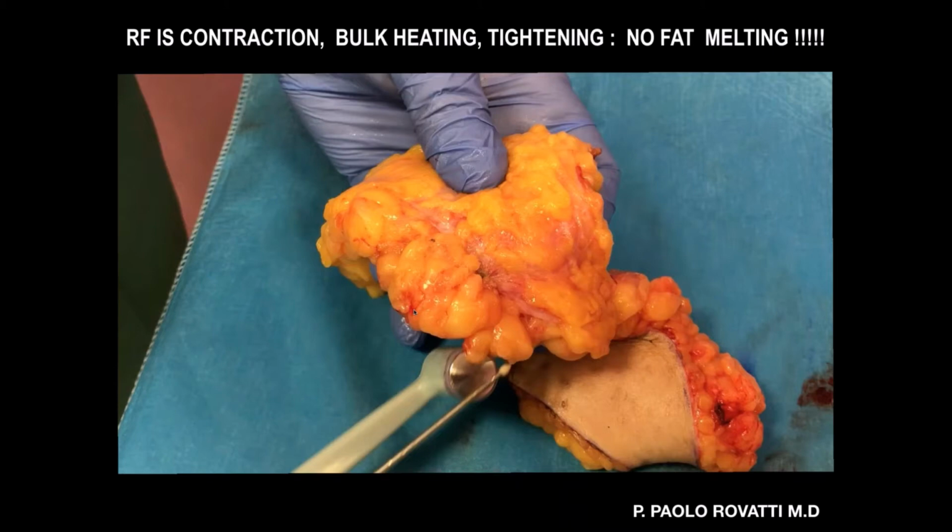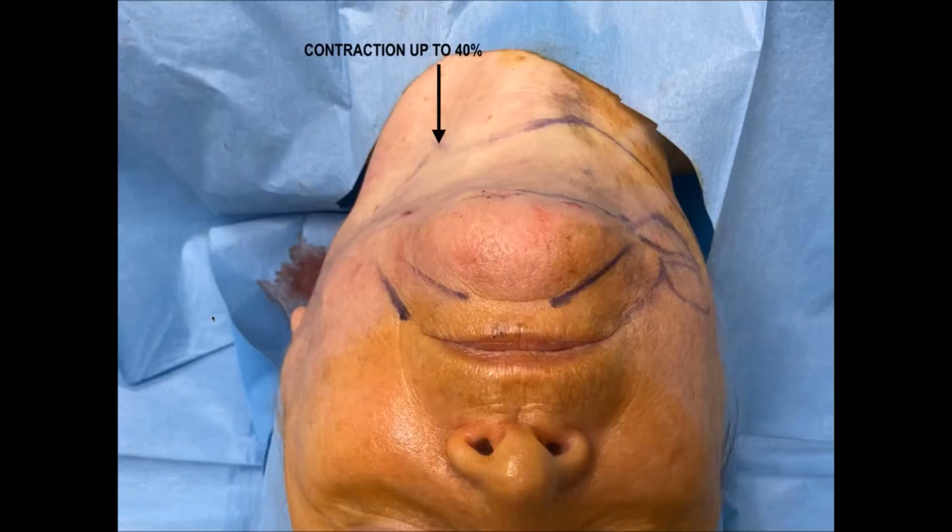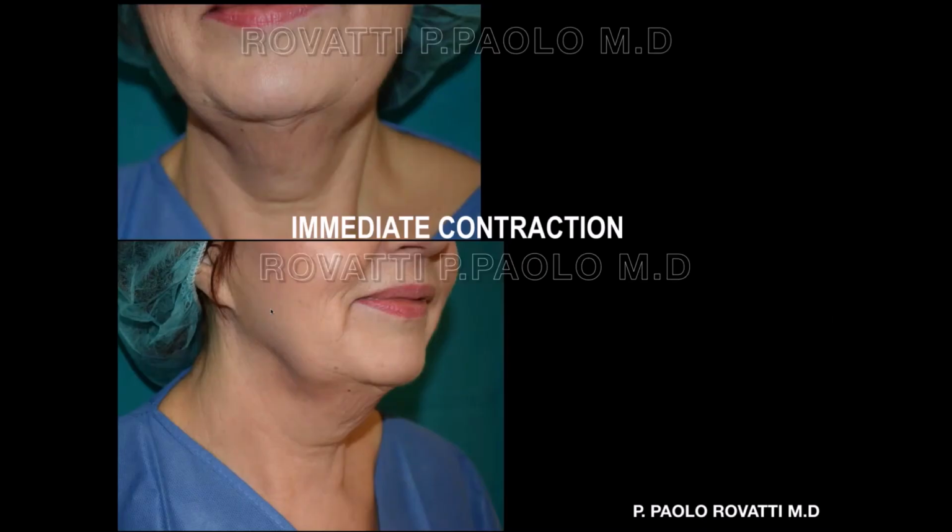You can see here on the left side of the patient a great contraction, because this is the side that we have treated. On the right is not yet treated, and you can see that there is more volume. Only contraction, but this is enough. So what you can see is immediate contraction that we don't know exactly the percent, but sometimes it's going to 40%, maybe in 3 months, maybe in 6 months. But immediately, this is the result you can have.